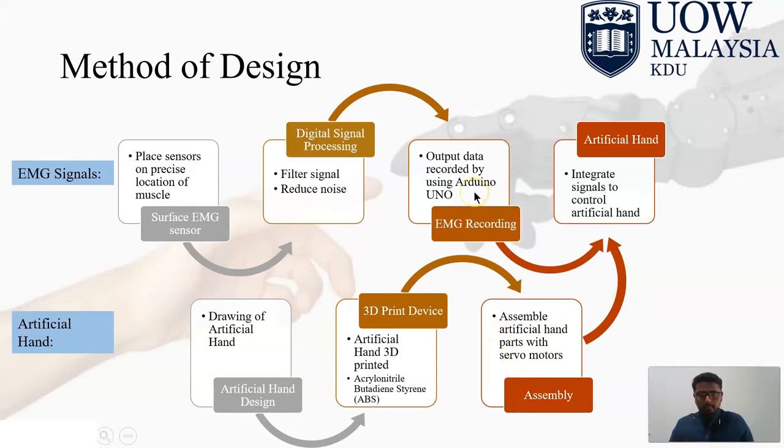Once I am able to finish the assembly, both the data of the EMG and the assembly will be integrated together, where the signals of the EMG data recorded will control the artificial hand.